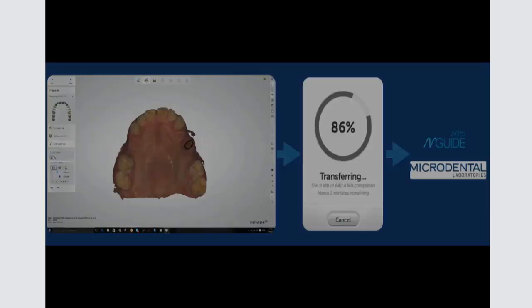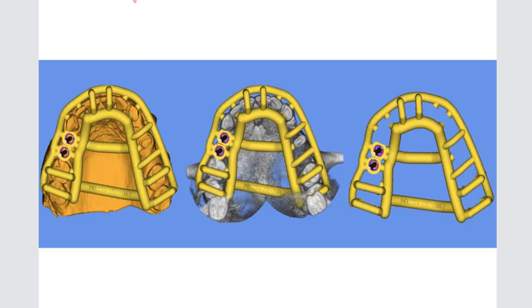Some other ideas and some other different guides, and I will show you right now, which belongs to this company. So you scan your patient and send for design. This is what I call tubular. That depends on how you design. If you have a software like Implant Studio, which is the one that I like, you have the possibility to open windows. You can open windows as long as you do not make the guide weak, and you open up with caution and make sure that the windows are strategically positioned for you to see what you're doing.